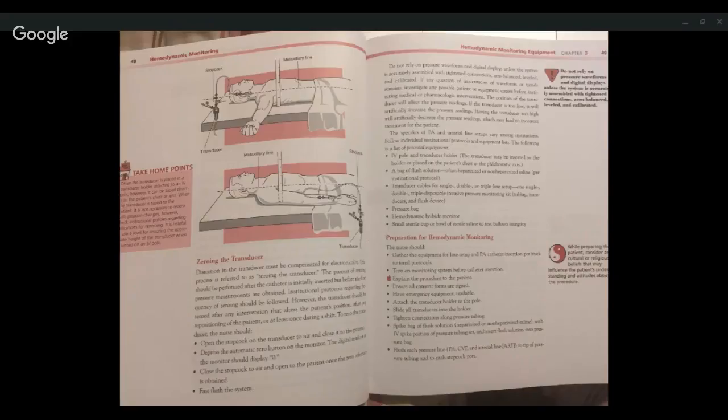Do not rely on pressure waveforms and digital displays unless the system is accurately assembled with tightened connections, zero balanced, leveled, and calibrated. If any question of inaccuracies of waveforms or trends remains, investigate any possible patient or equipment causes before instituting medical or pharmacologic interventions.